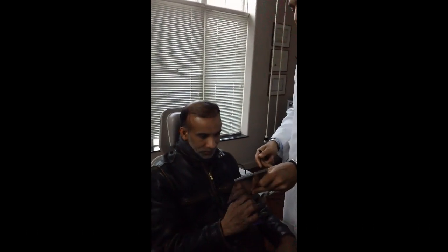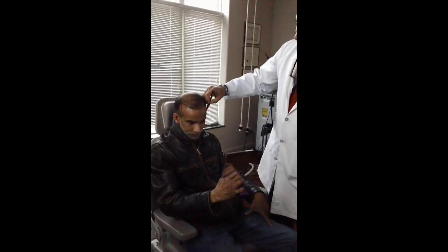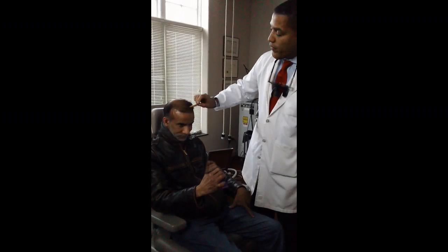So we're going to take it from here. In this area, we're going to do approximately 2,000 grafts. So we're going to do more than we did before to add density here, pull out his temples, and go back a little bit further. I'm going to show this to you, Yaba, and see what you think. I drew all my schematic lines here. Stay with your hairline here. Bring out these temples and go back to here and add more hair in here, because we've got a good framework.